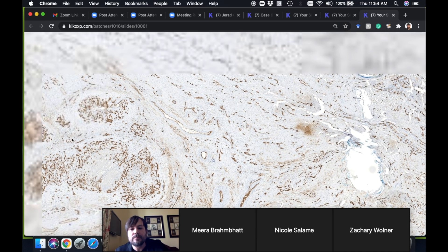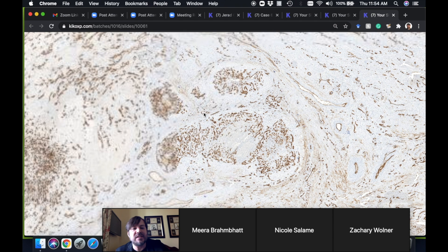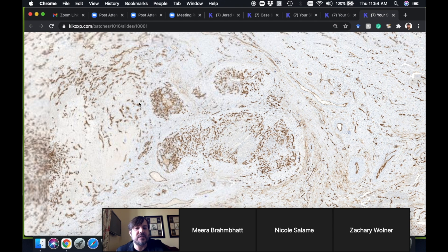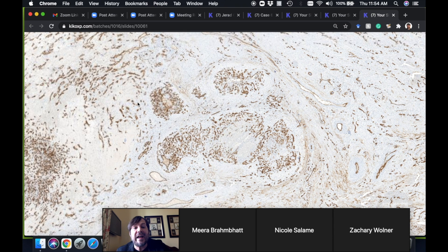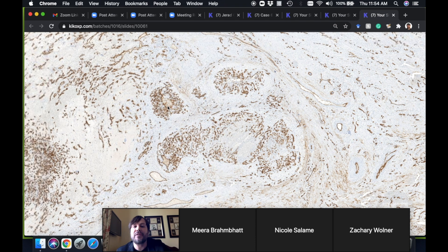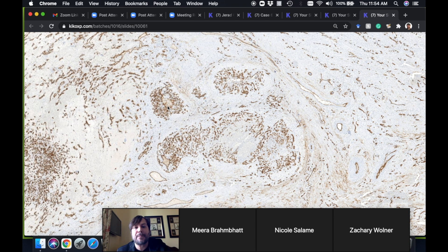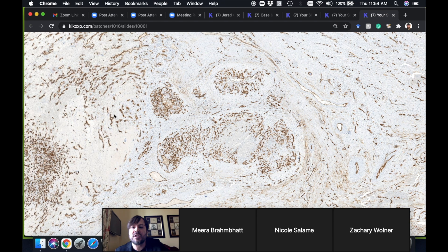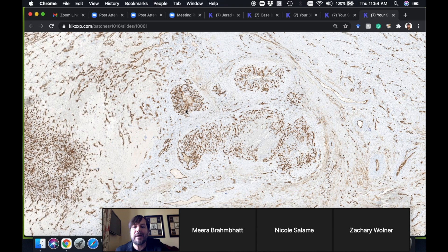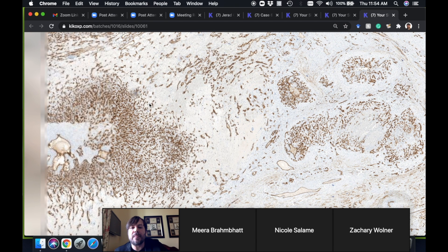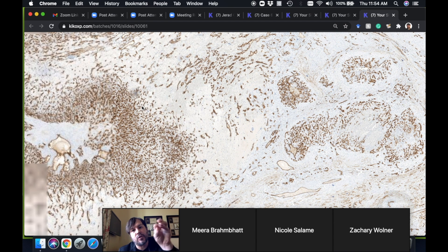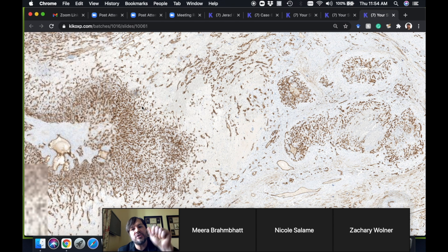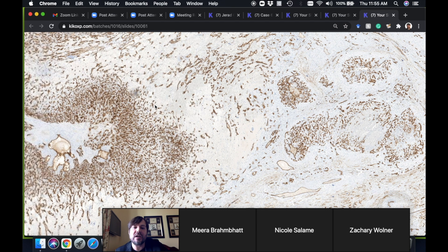So CD34 is not a specific marker for vessels. In the setting of angiosarcoma it can occasionally be lost, but there are certain times it helps. It's really good in Kaposi sarcoma because Kaposi sometimes loses CD31—the HHV8 virus can cause down-regulation of the CD31 molecule. The other thing is CD31 will stain histiocytes also, kind of a grainy, grungy stain. CD34 doesn't do that.